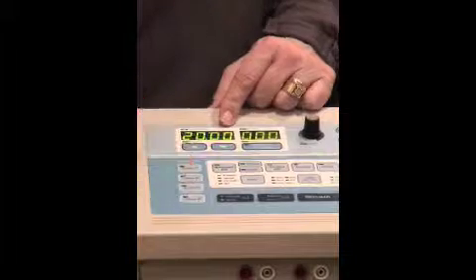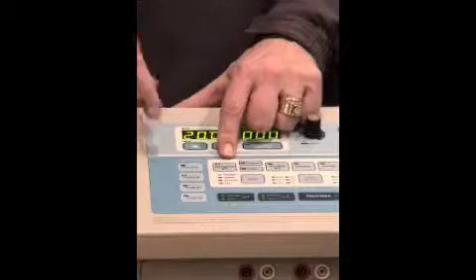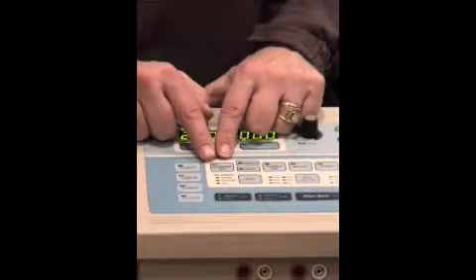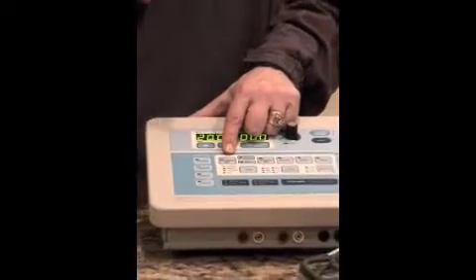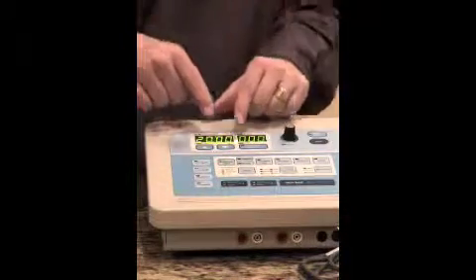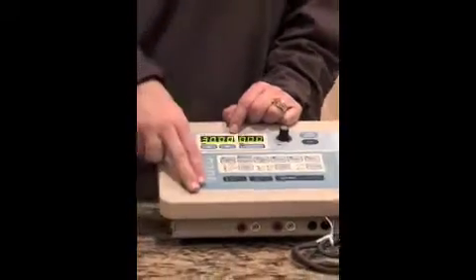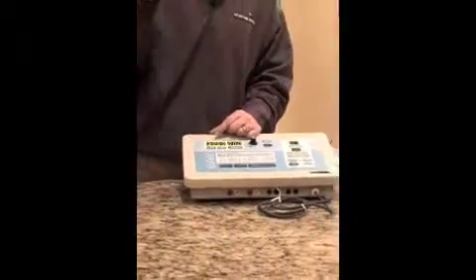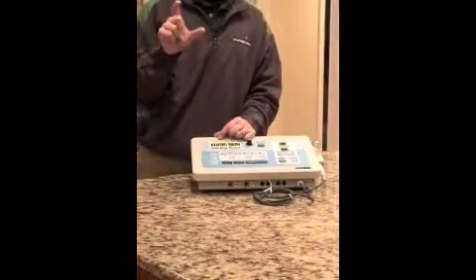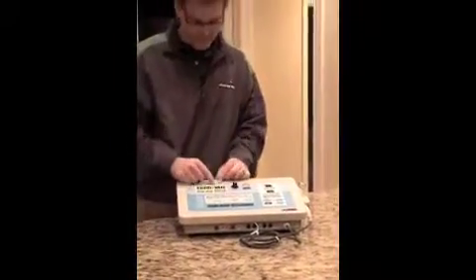Profile B comes from the factory as quad polar interferential. The difference is that quad polar interferential uses both channels — four pads set up in the butterfly configuration. Pre-modulated means we're just going to use one channel, so two pads, and the machine mixes the waveform internally rather than on the body.